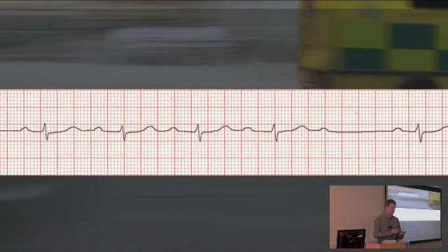Okay. So then we're going to ask, is there any atrial activity? There's atrial activity in the P waves, aren't there? Yeah. And how is the atrial activity related to the ventricular activity? Well, you've got a P wave and then a QRS complex here, haven't you? And again there, and again there. But what's the PR interval doing? It's quite long here, isn't it? It's already quite long there.